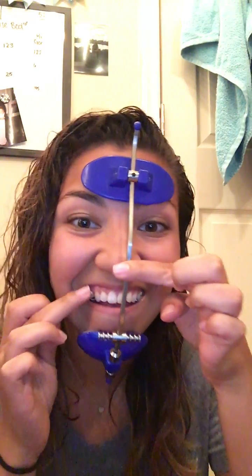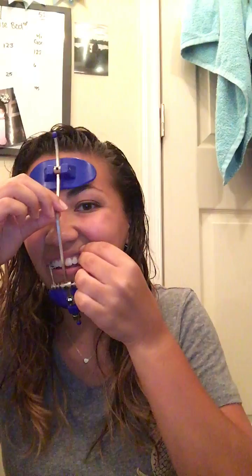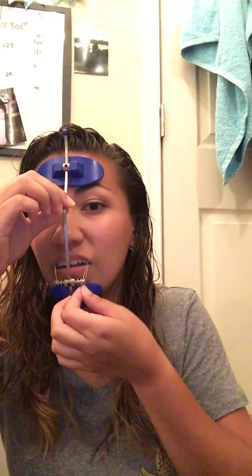Alright. So what you'll do is place it here, and then mine has hooks here, so I can hook it there, but a lot of people have the clasp all the way in the back to hook it here, so you'll go from one to the other and do it here. Some people will have to wear 2 rubber bands depending on how much it needs to move, or have it closer together. I just wear mine there.